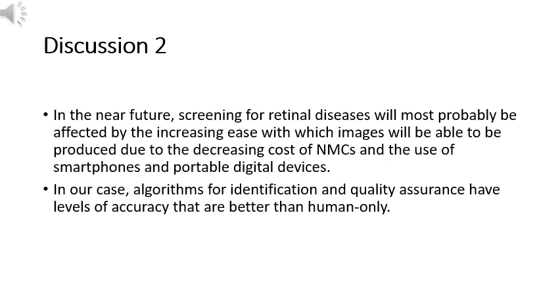We believe, however, that the use of quality algorithms may be a more appropriate measure. It has a short feedback circle, even during the image-taking process, thus offering a greater guarantee of quality and more cost-effectiveness. Other authors have also used quality algorithms, as was the case with Vardarajan et al. 20, who had to exclude 12% of the images of one of their datasets due to poor quality.